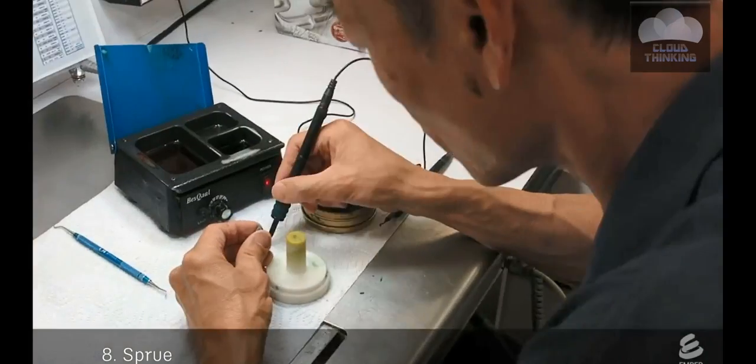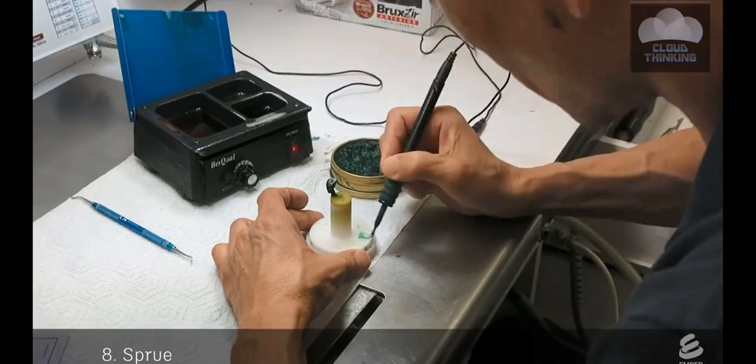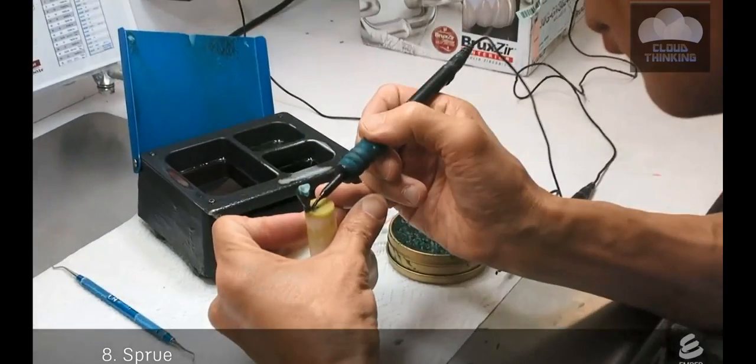Another technician sprues the crown. They use wax to attach it to a stem. This will create a passage for metal to flow into the crown during the casting process.